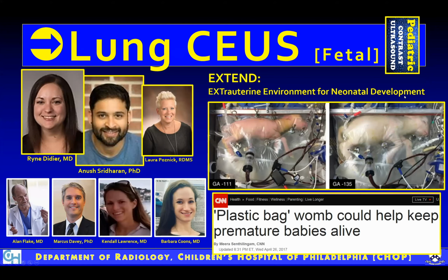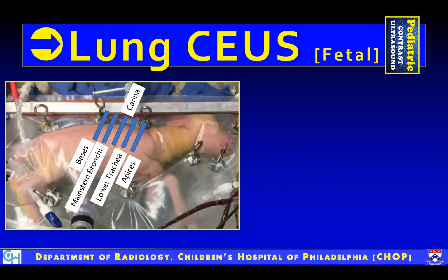They're using a fetal lamb to produce an artificial womb, which is now so far developed that basically in the next year, maybe 2, we will be also trying this out in premature fetuses. So the collaboration our group has with the surgeons who created this is, one, to look at the lungs and the lung perfusion. And this is where they scan the fetal lamb.